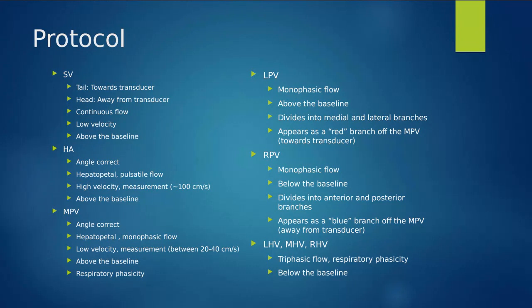Here we have our hepatic artery, so we're going back to our porta hepatis. If we look too, this is a really nice right portal vein coming off right here, kind of a grainy picture, but still a nice shot there. We are looking at the really tiny vessel sitting right above that main portal vein there. So we have our spectral analysis. We see that arterial flow. This probably is a biphasic waveform. Spectral analysis is not that great right there, just because this is a grainy picture.